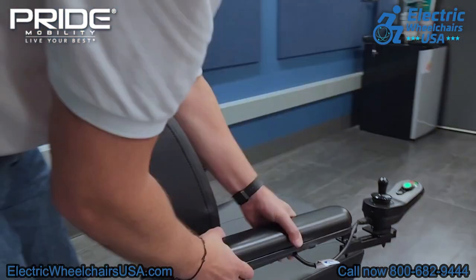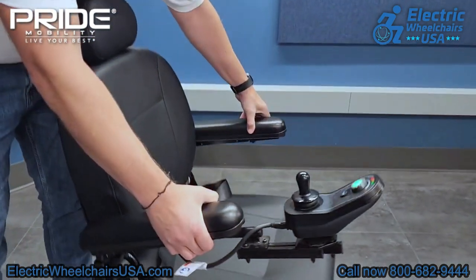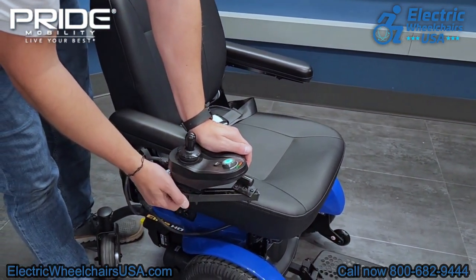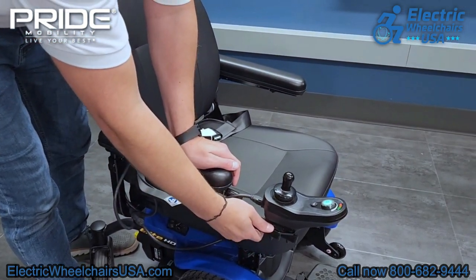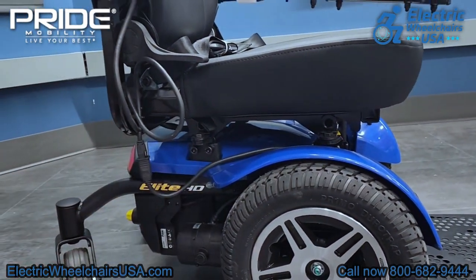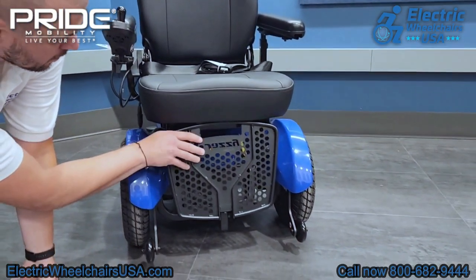The armrests on this chair also flip up, so it's easy to get in and out of the chair. Additionally, the joystick is a swing-away joystick, so you can swing that away as you're getting in or out of the seat to ensure that you don't damage the joystick. The Elite HD has a four-post seating system for added support, and the footplate flips up for easy entering or exiting the seat as well.